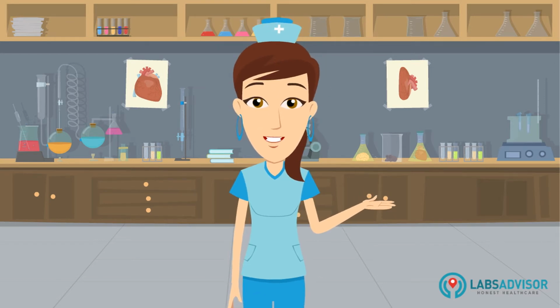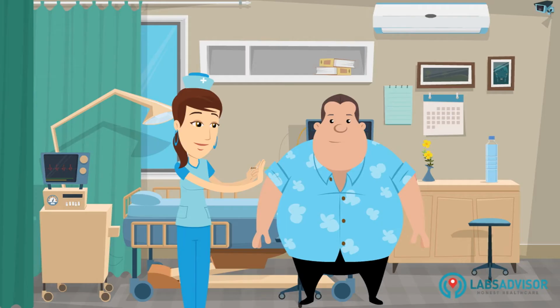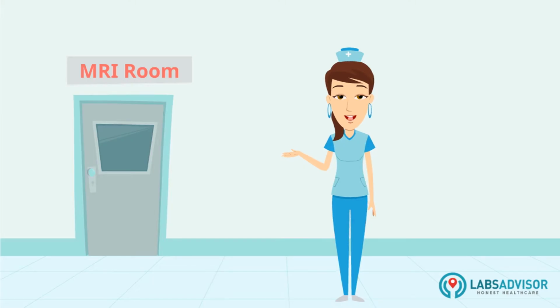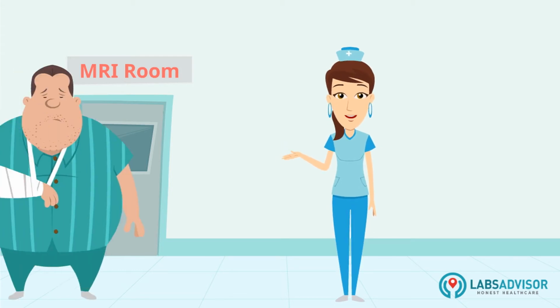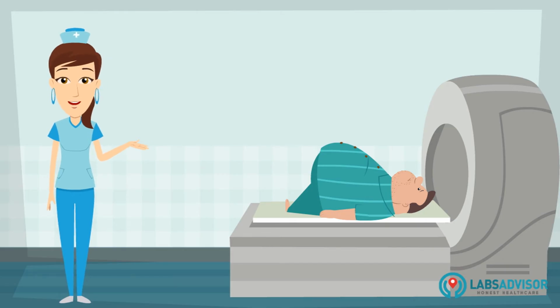Normally, an MRI scan is not recommended for people with pacemakers, cochlear implants, and pregnant women. In certain cases, a contrast dye may be given orally, or injected into the vein a few hours before the test to obtain a more detailed image. You are restricted from carrying any object with metallic content inside the MRI room. You may be asked to change into a gown before the procedure. You should lie down on a table that slides into the MRI machine.